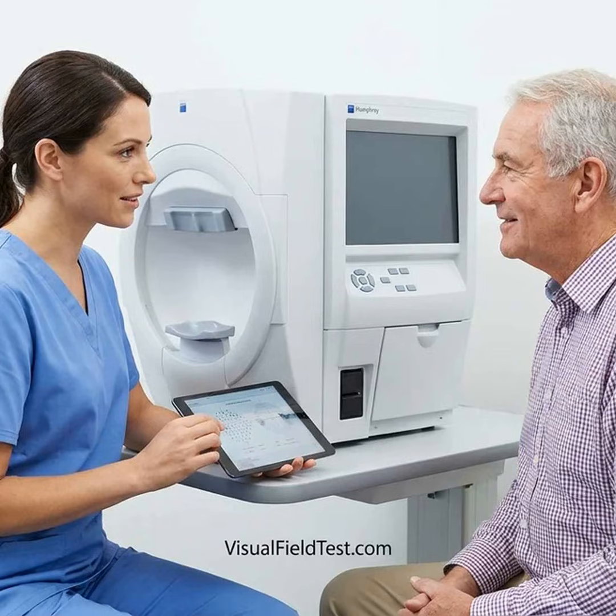In the 2022 educational video audit, patients completed a 7-question assessment. Among patients with unreliable tests, 76.9% scored fewer than 4 correct answers. Every patient who scored more than 4 correct answers had a reliable result. This finding shows a strong association between understanding and test quality, although it does not prove that the quiz alone caused the improvement. Practice tests.